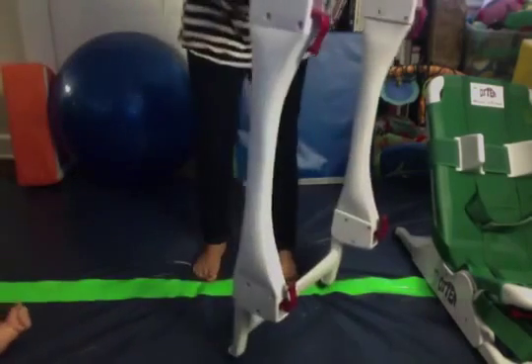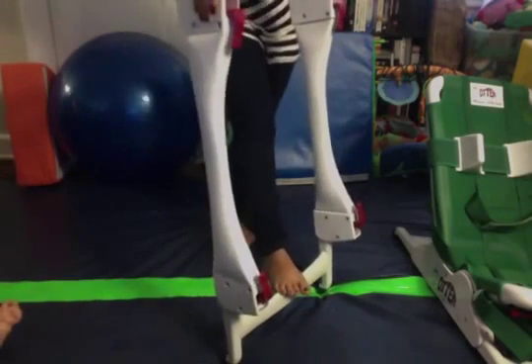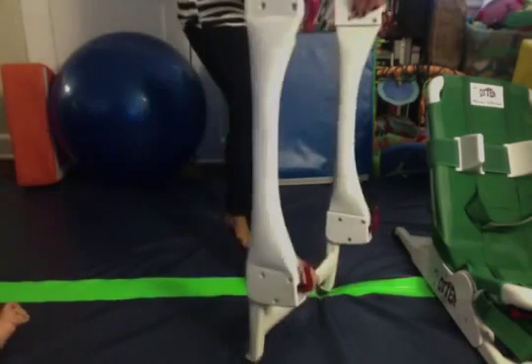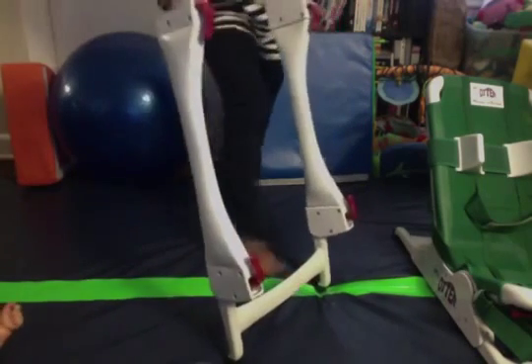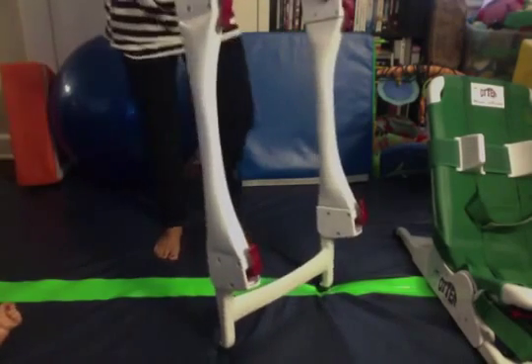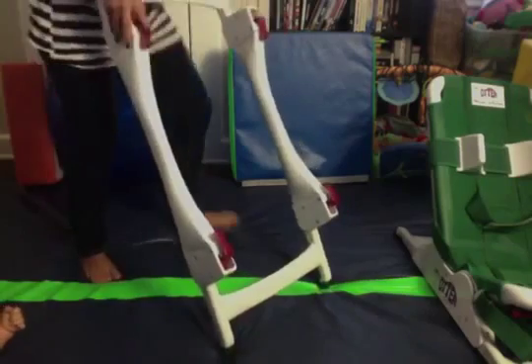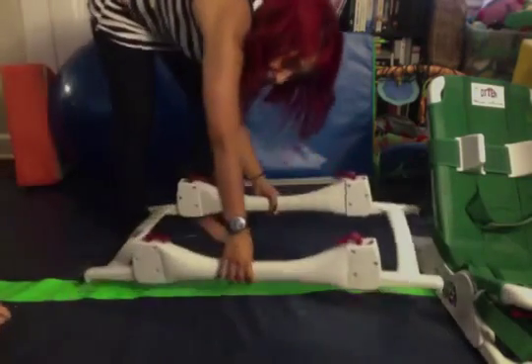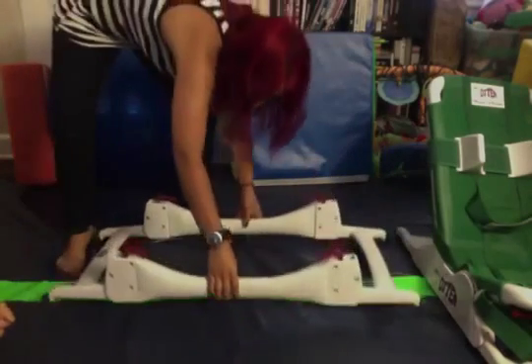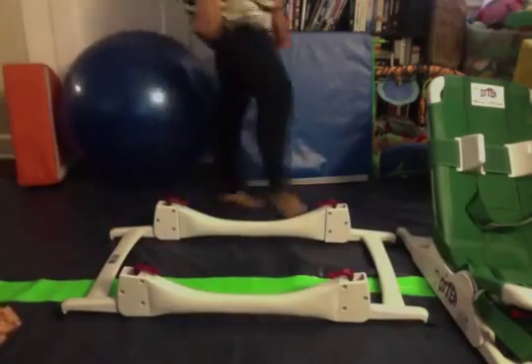It takes quite a bit of muscle, but this can lay all the way flat too, which is great for easy storage. We just slide it underneath the crib.